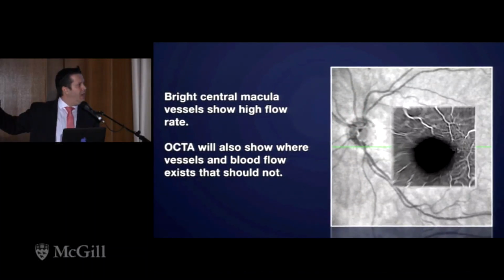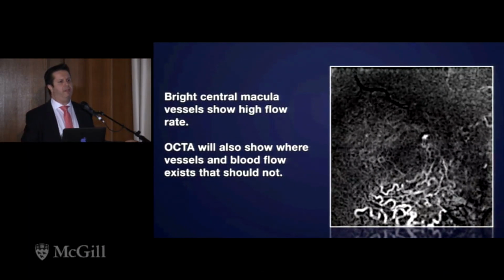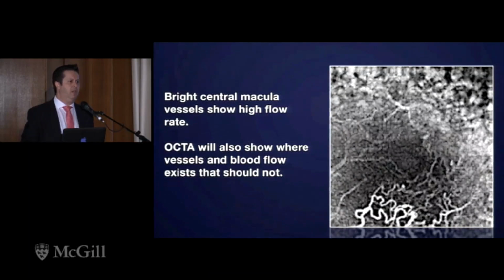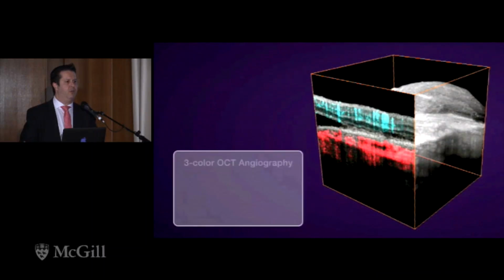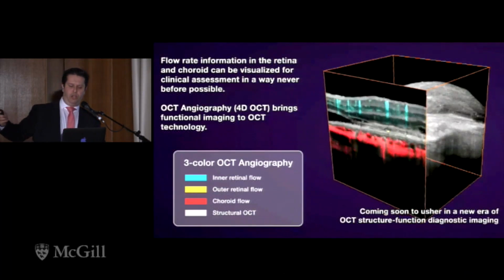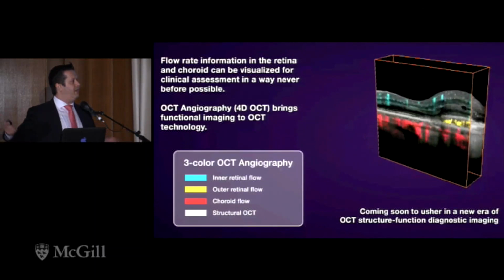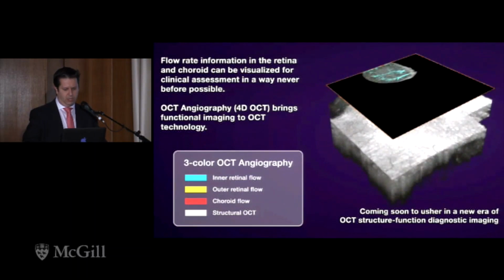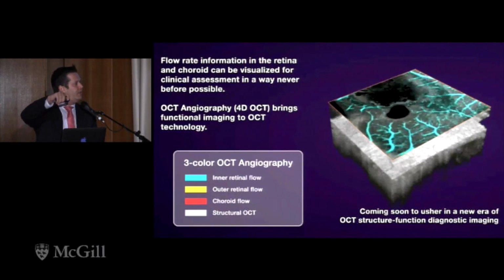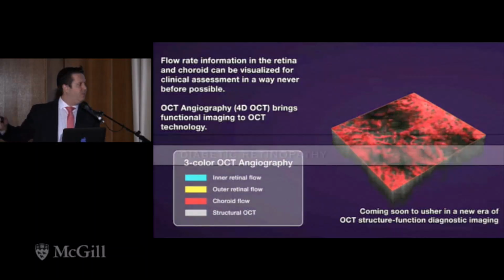So how about in patients with diseases? How about in patients with diabetic retinopathy, in AMD, or in ocular tumors, and so on? How do we see them? To start off, I would like to show some practical cases of regular diseases that we see on an everyday basis. Here's just an example of a neovascular membrane. We can see it in a very nice way.